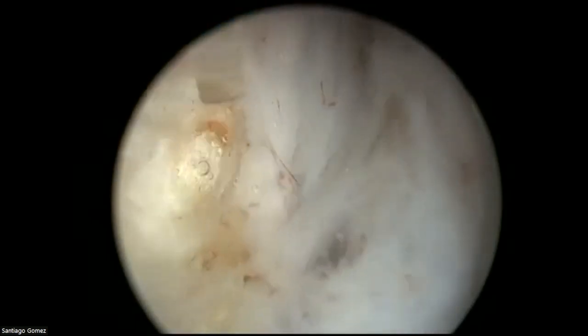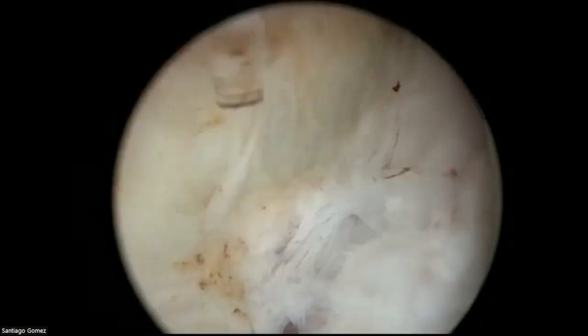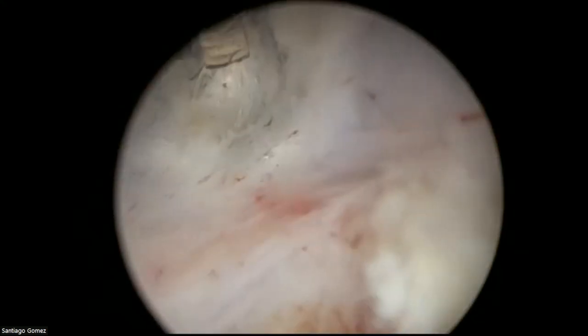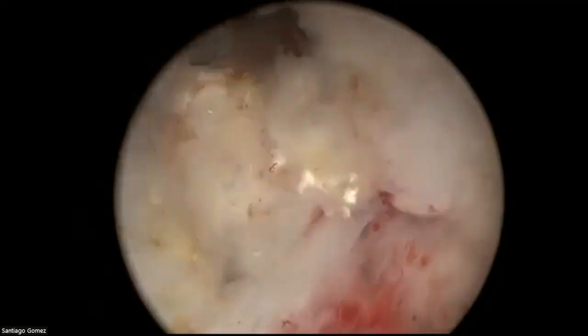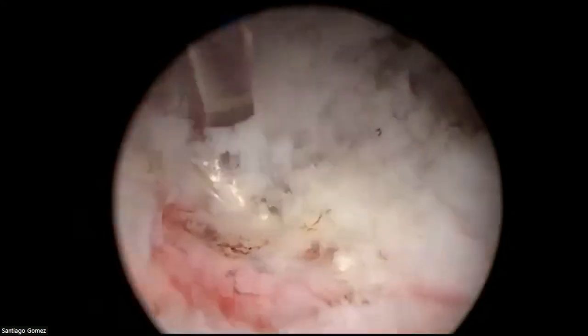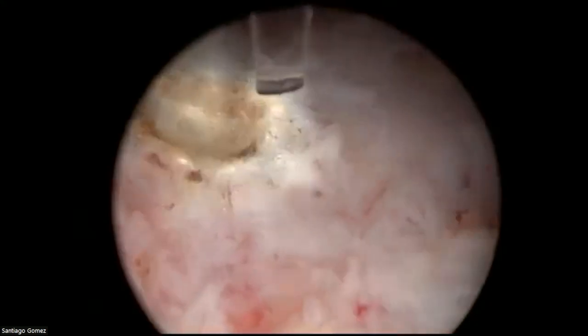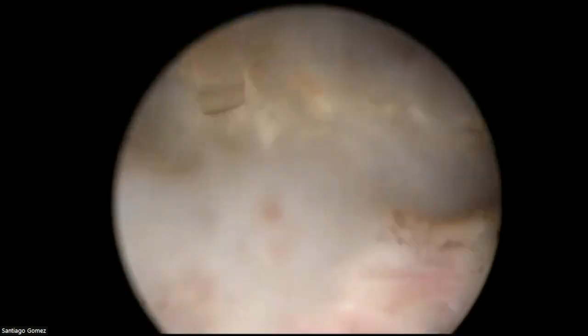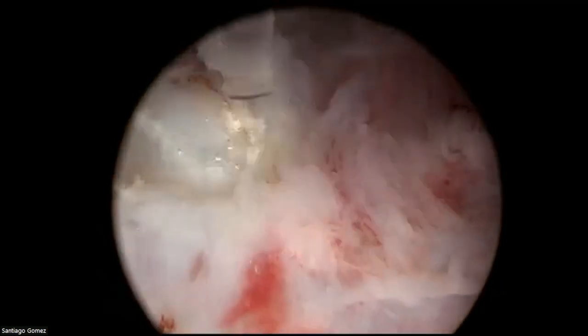And in the areas where it's difficult to see the beautiful plane, it helps you a lot to realize that you are more or less at the right depth of the dissection. Of course, you have to analyze the tissue you see all the time and you have to judge. For example, down here, you see we had some yellow tissue, remember at the beginning? So here it looks as if there could be some more tissue here. Let me try. And you see that we can deepen quite safely.